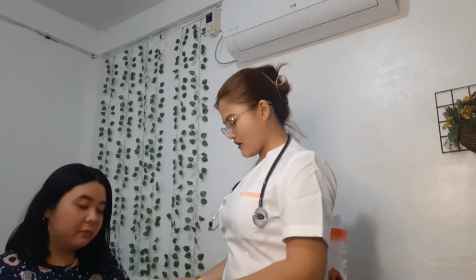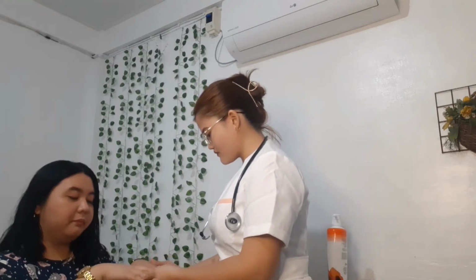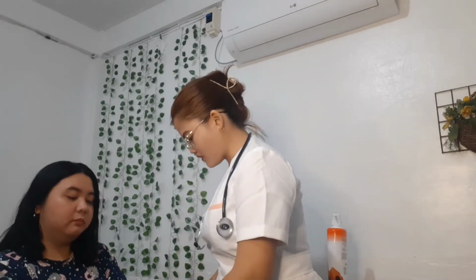So ma'am, patingin nga po kung may cutics kayo. Okay? Wala. So, the next thing you need to do is check the hand temperature. So, ma'am, pahawak po ng inyong kamay. Okay? So, next is, the patient needs to relax her body in order to place the pulse oximeter in the middle finger.